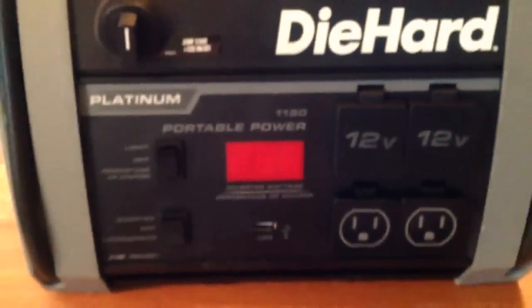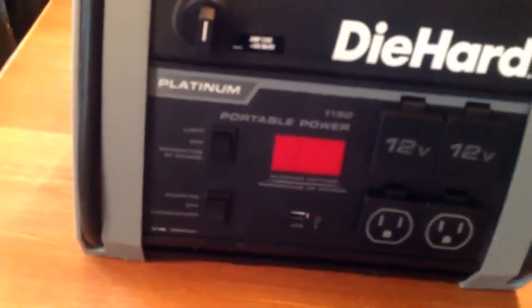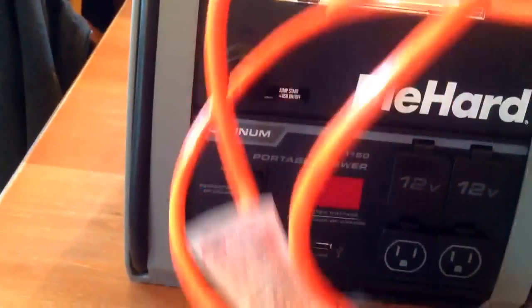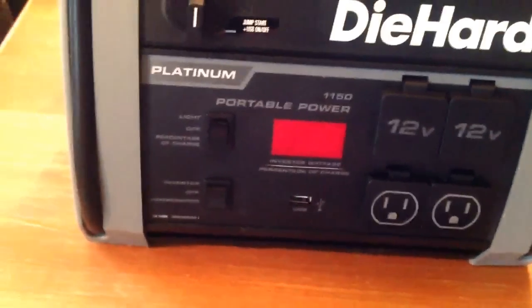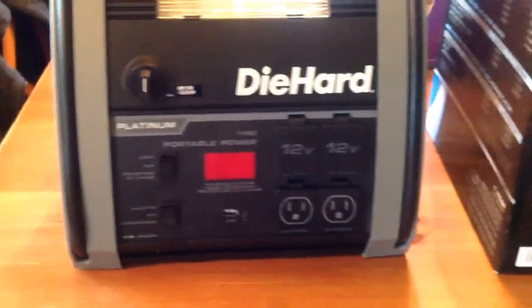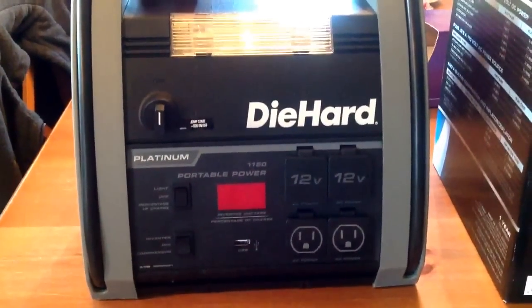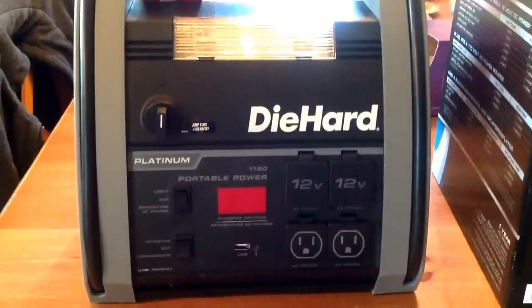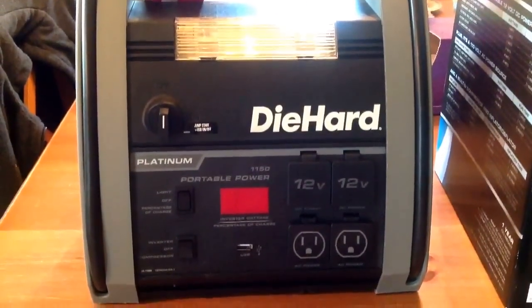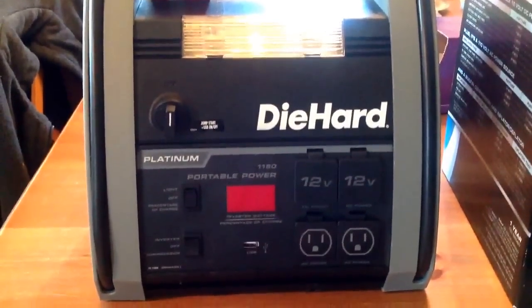Now, what you need to do when you buy this thing is plug it in with an extension cord. I have this extension cord in the back that I bought. You've got to plug it in once you get it home from the store and charge it for 3 days to get it all charged up before you even use it at all. They say the second you get it home, charge it for 3 days before using it. And once a month, charge it. Make sure it stays charged.